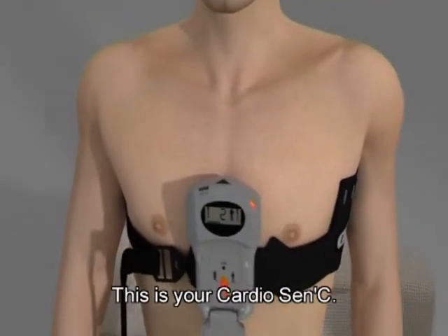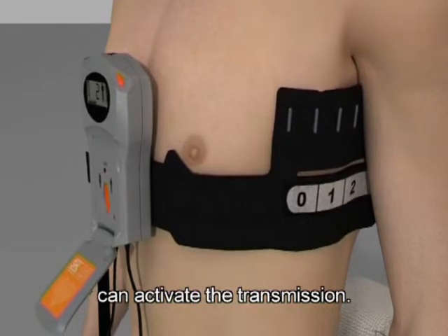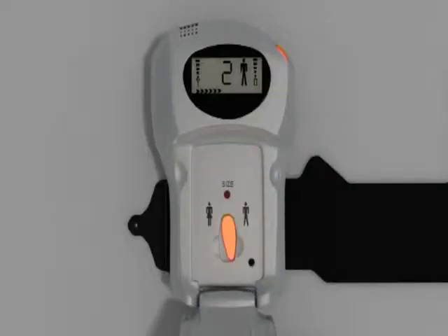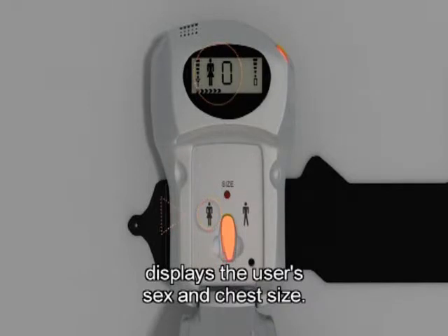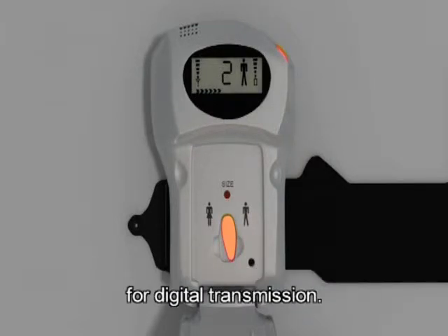This is your Cardio Sen'C. Once it is properly placed and secured on your body, the medical staff at the monitoring centre can activate the transmission. You can also transmit the ECG yourself simply by pressing the button. The small screen at the front of the device displays the user's sex and chest size. The indicator to the right displays the cellular signal strength for digital transmission.